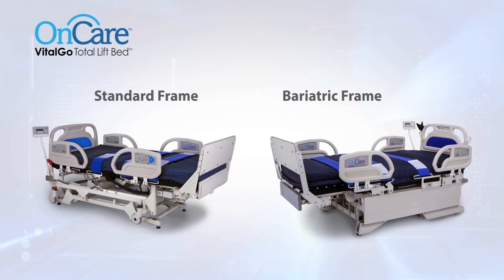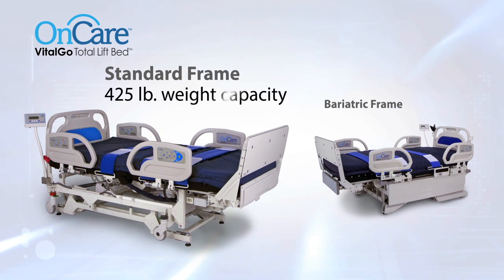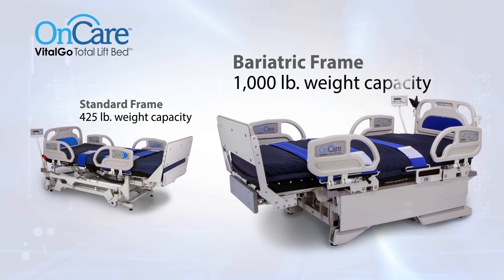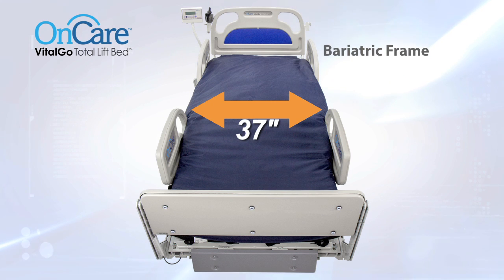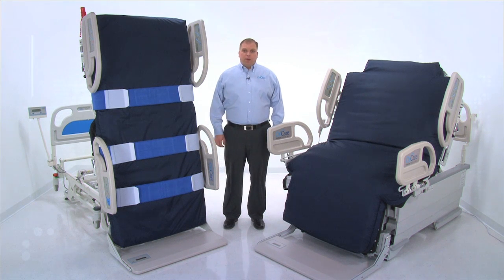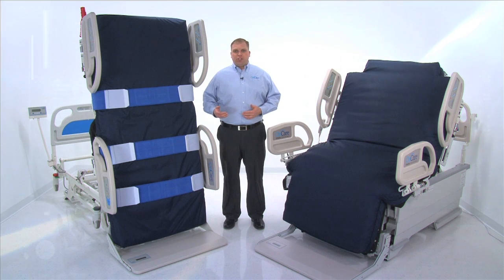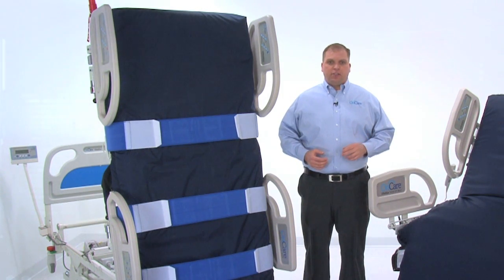The Total Lift Bed is available in two models: the standard size with a 425-pound weight capacity and the bariatric model with a 1,000-pound weight capacity. The width of the bariatric model is expandable from 37 inches to 48 inches. In this demonstration, we'll also discuss bed controls, optional integrated air mattress, and cardiac chair position, and conclude with a detailed demonstration of the tilting function.